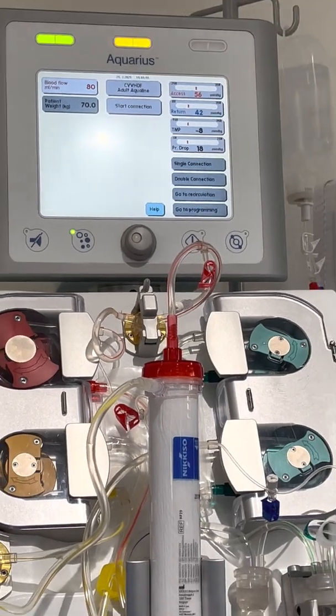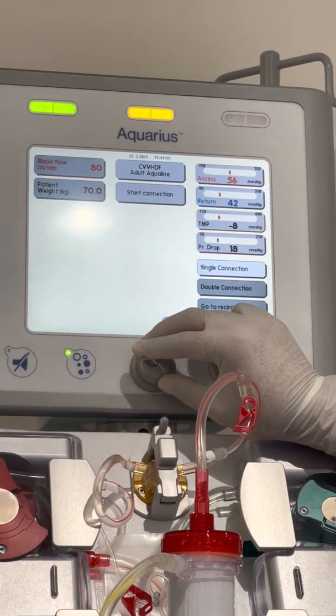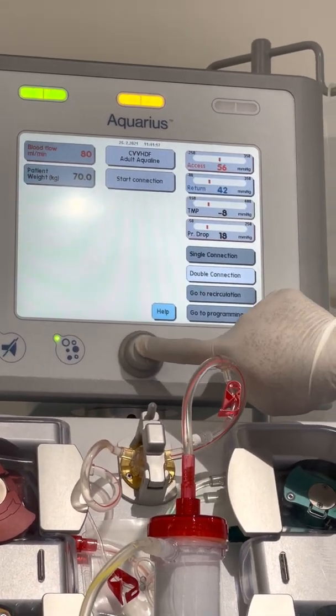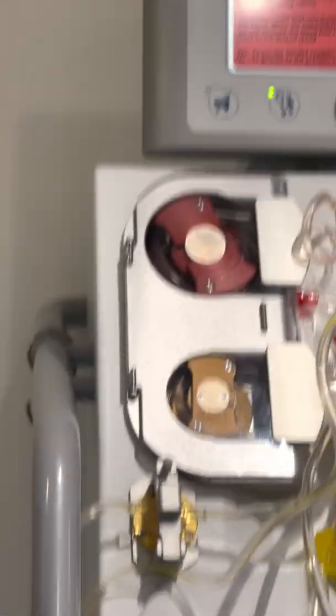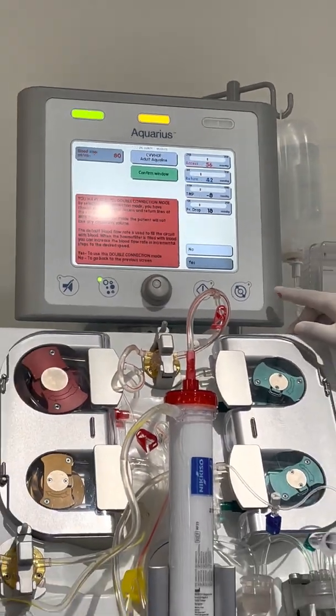That's all. How do you start? Right here, for example, we're choosing double connection. Then we're going to connect to the patient, then press yes. That's it. It will start and it will run.